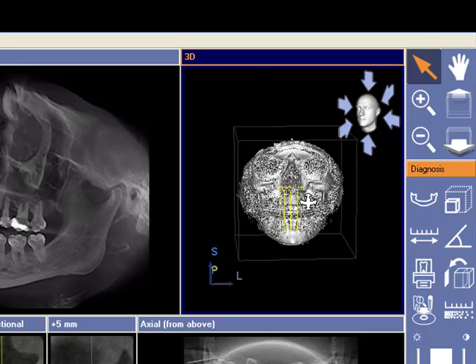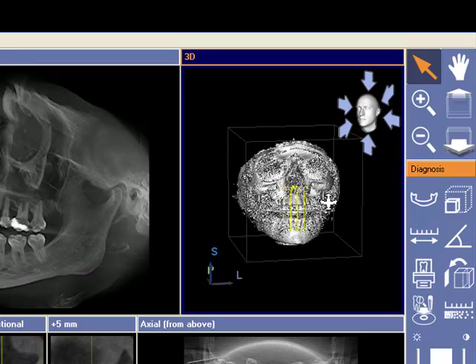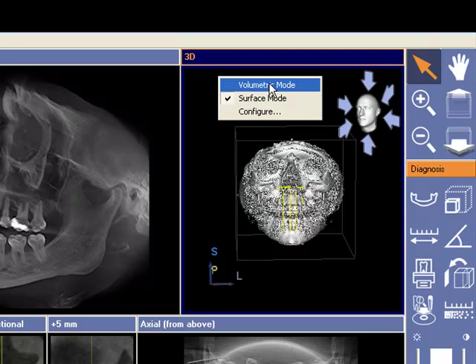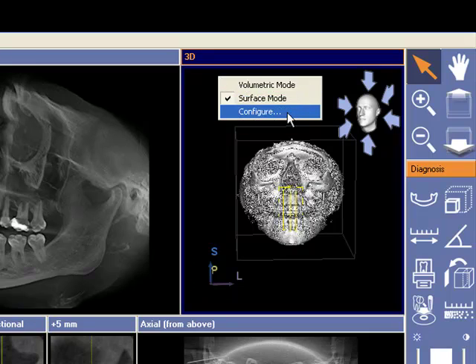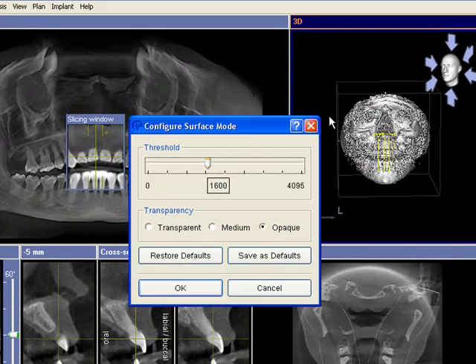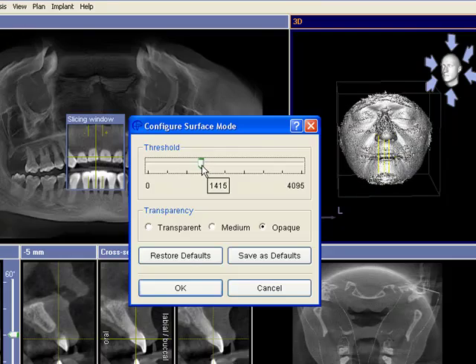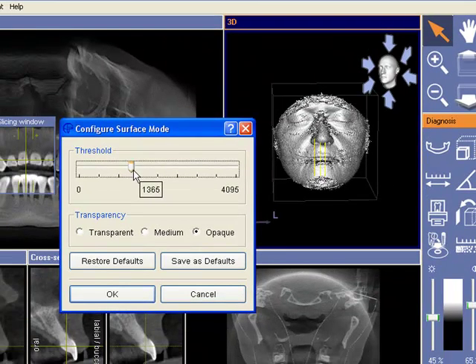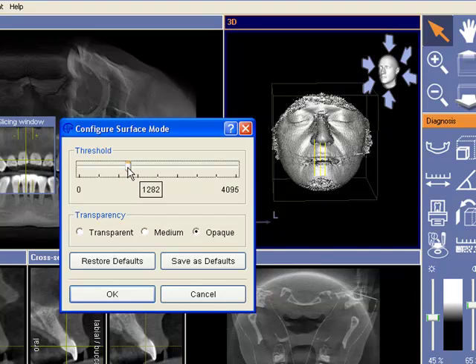So that's changed our image there a little. We'll need to change the threshold so that we can bring it up or down. Right mouse click just above and go down to where it says configure. Now we'll be changing this threshold bar, bringing it down just a little, and you can see it's changing the appearance of the 3D, getting more defined and getting more features. Change it to where you're comfortable with the threshold and click OK.